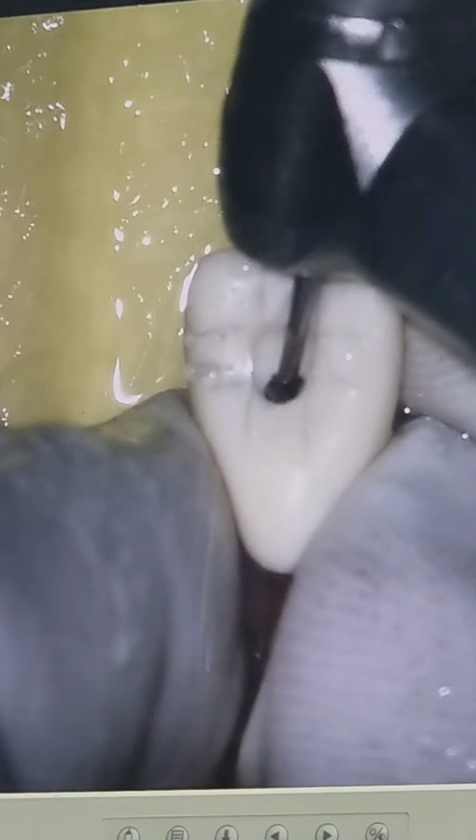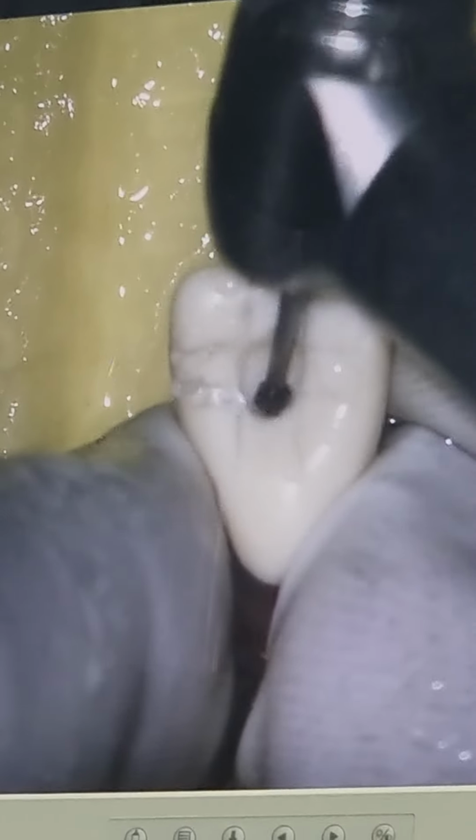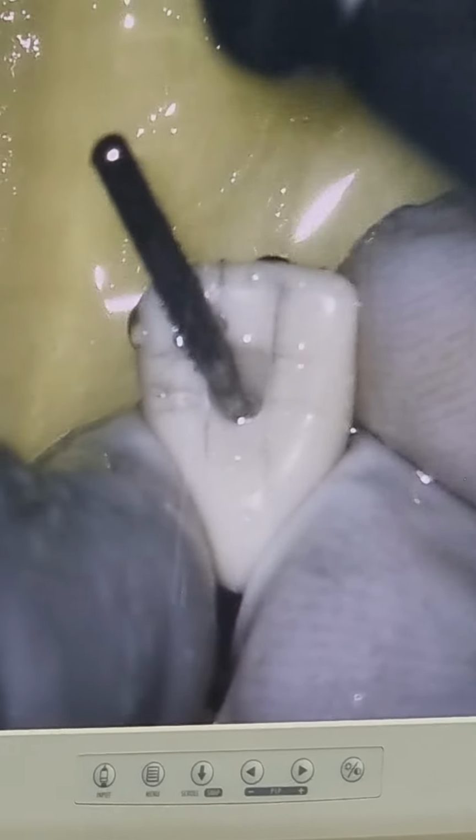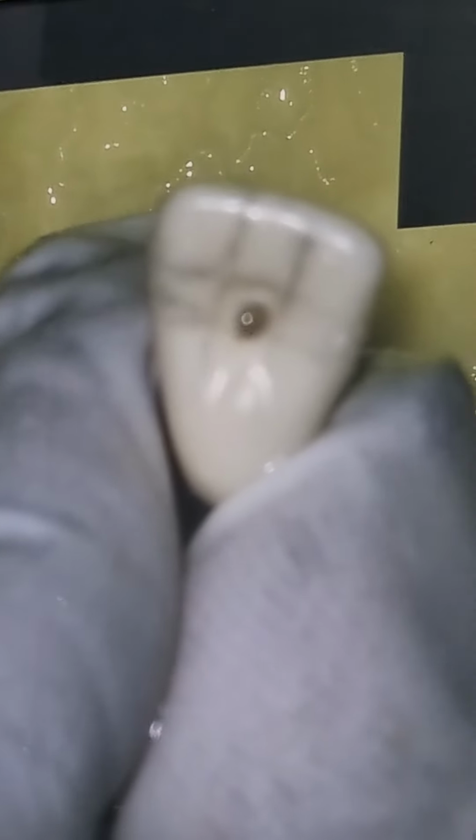Now we are into the dentine, now going for the pulp chamber. You can feel the drop anytime now as you go down. You see that? That's what came out. You see this dark black area there? What is that? That is the drop. You saw how the bur went inside, that was the drop-in effect.